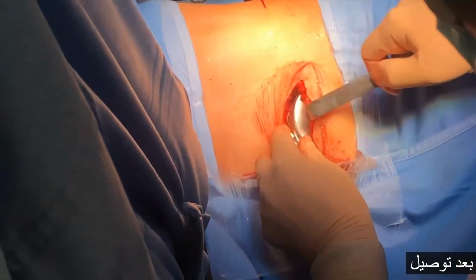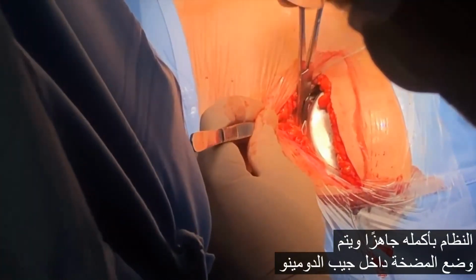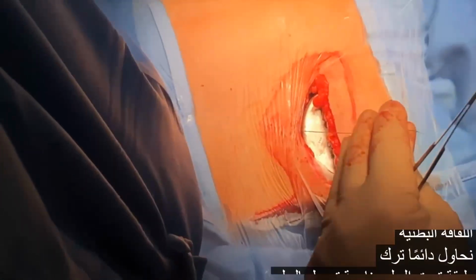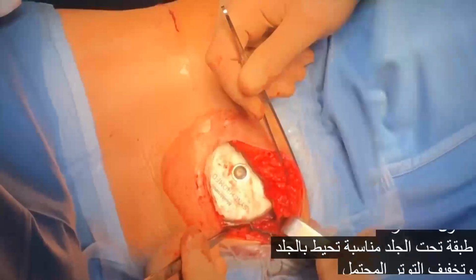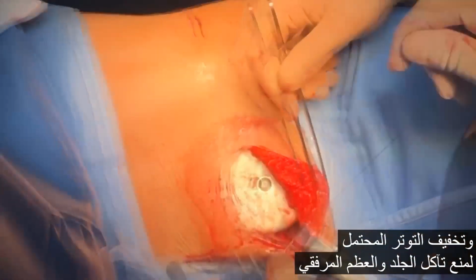After the connection of the extension catheter to the catheter port of the pump, the whole system is ready and the pump is placed inside the abdominal pocket. On the sides of the pump, several suture loops are used to secure it to the abdominal fascia. We always try to leave an appropriate subcutaneous layer enclosing the skin and to release possible tension in order to prevent skin erosion and decubitus.